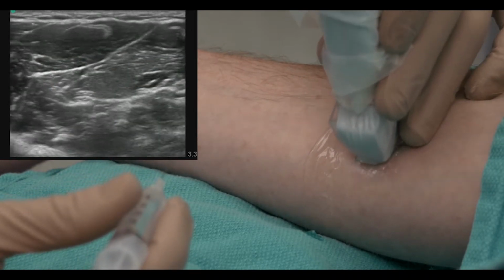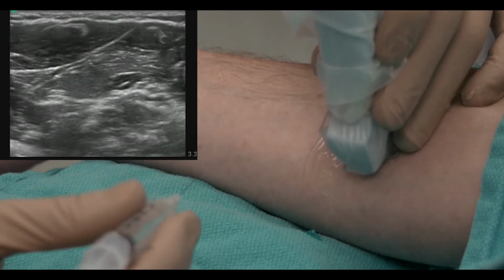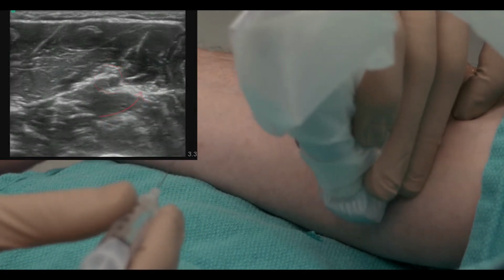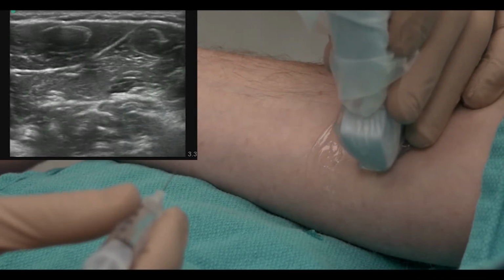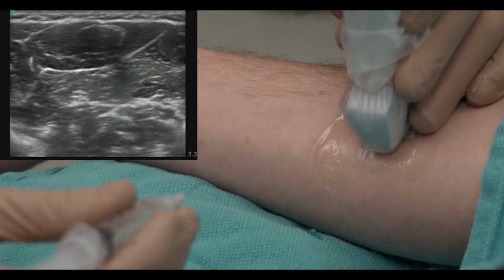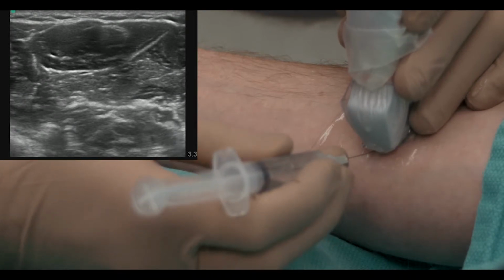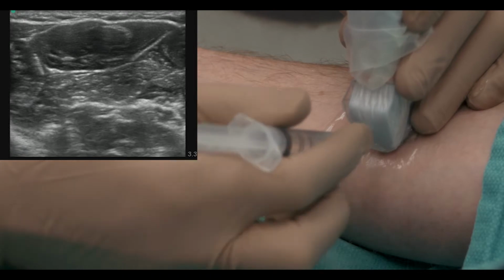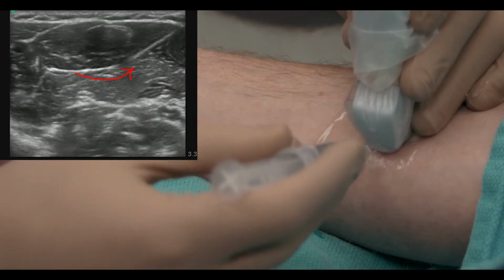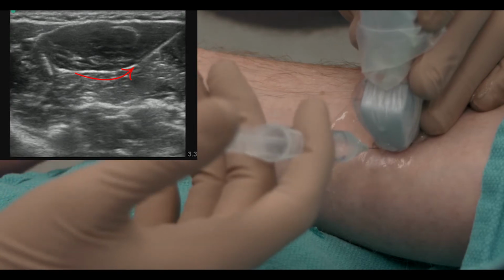For this block, I think the ulnar side is a little bit farther away, so I'm just going to come in from the ulnar side because the ulnar artery is sitting way over here, and so that's more out of the way. From there we're going to again come in plane, so if you follow my hand in here, feel a little bit of a poke here, my apologies. And then we can see the needle coming in through the screen here. If I wiggle it just a bit, we can see it moving through.